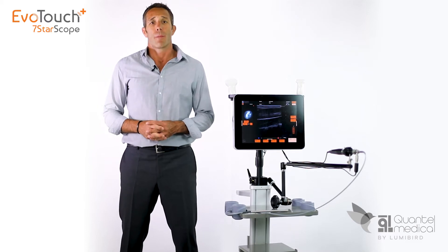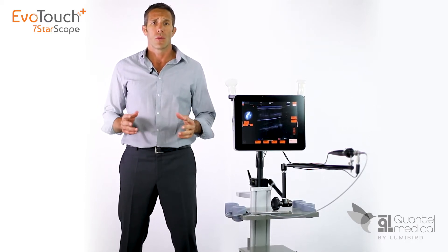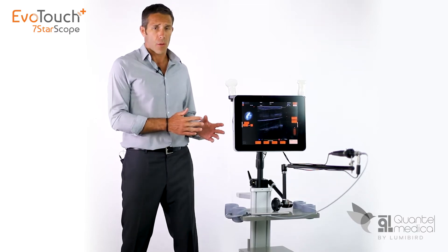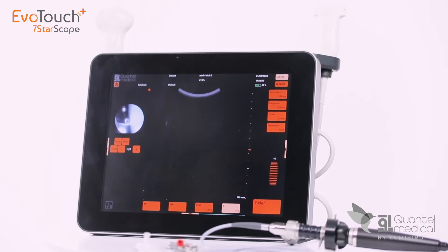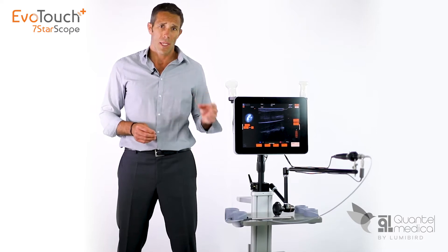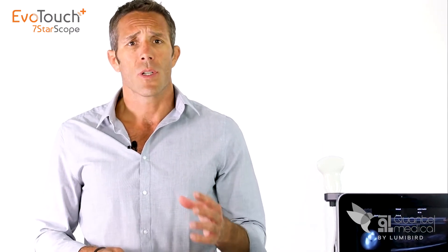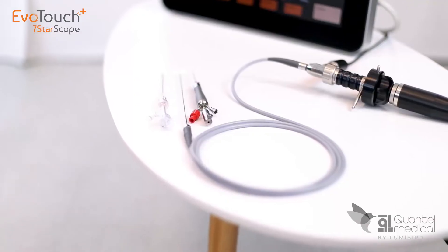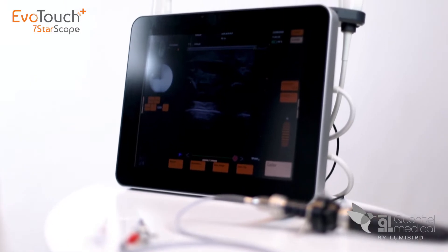My name is Alexandre Oliver, product manager at Quantel Medical, and I would like to introduce you to the EvoTouch Plus 7StarScope, which will enable you to switch from procedures that were previously performed blind to procedures performed with direct visual tracking, thanks to the unique technological coupling of an ultrasound scanner, the EvoTouch Plus, and a micro endoscope, the 7StarScope — the real game changer of echo-guided approaches.